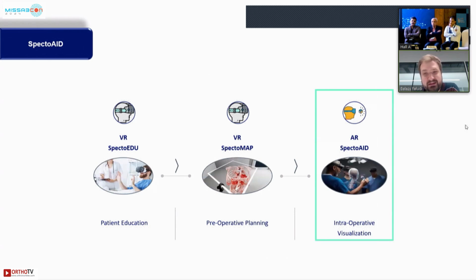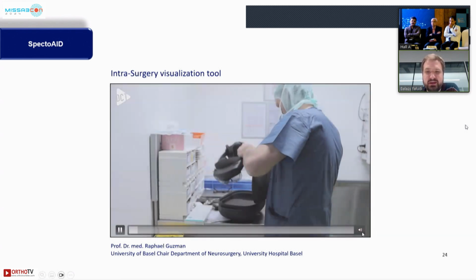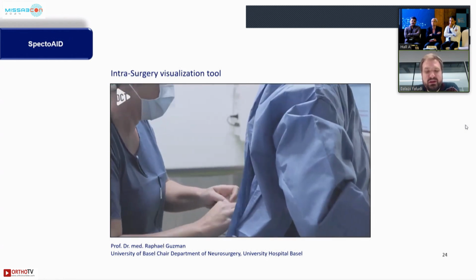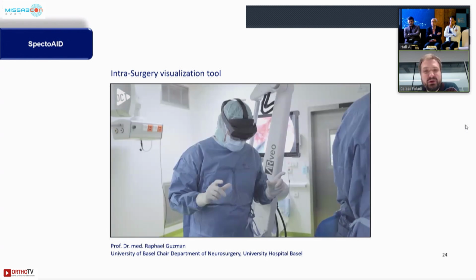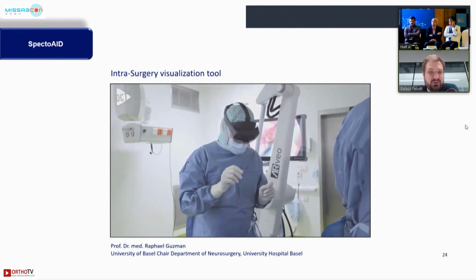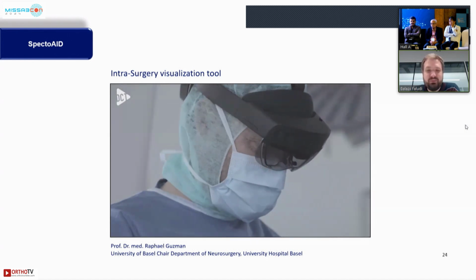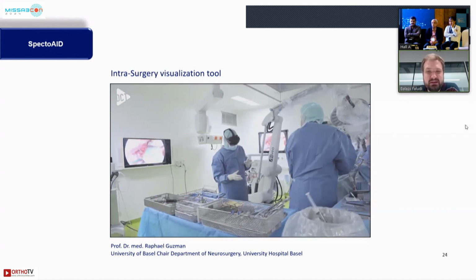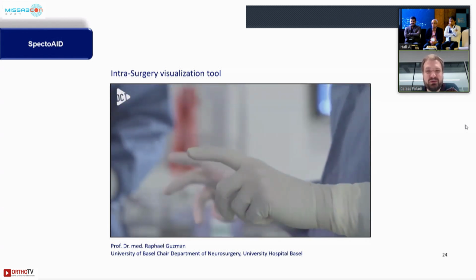And finally, the intra-surgery or intraoperative visualization with something like the HoloLens or the Apple Vision Pro. You can then take the plans that you prepared ahead of the surgery before in VR and then look at exactly the same prepared measurements or selected clips, selected implants in the operating room, have it as a reference and compare to reality.